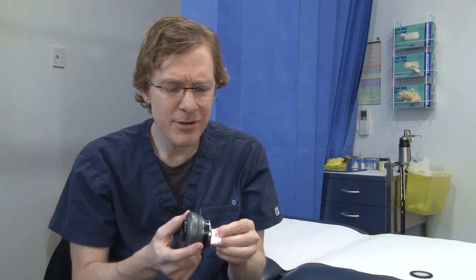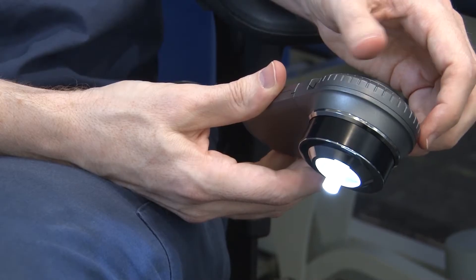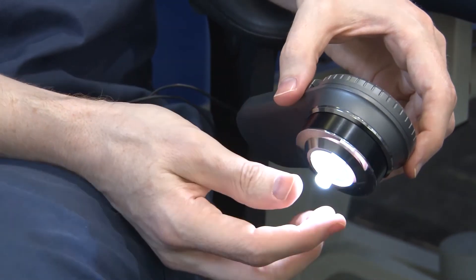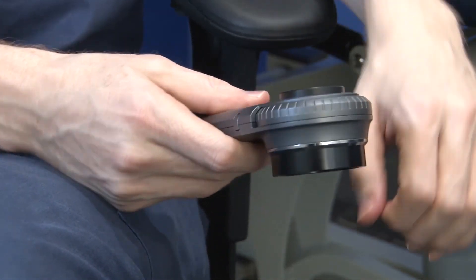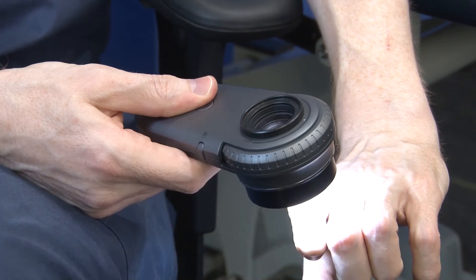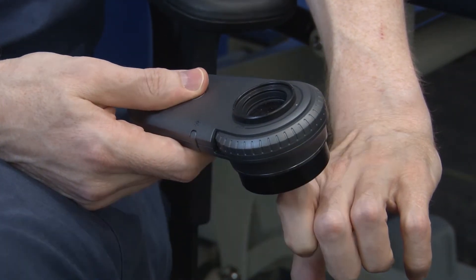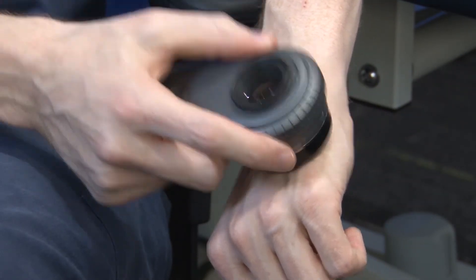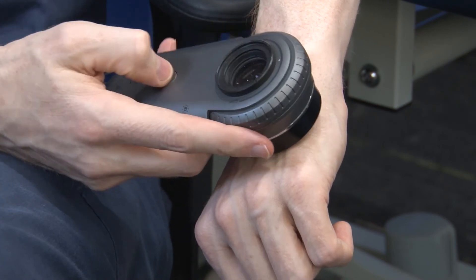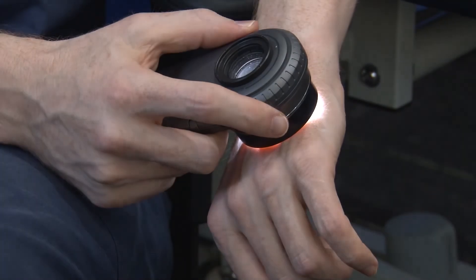That's a very strong magnet, really easy to pull on and off. You don't have to have any attachment on, in fact. You can have that completely removed and just look at a raised lesion and manually focus it that way. Or perhaps if you've got a pink vessel that you want to have a look at without compressing the vessels, make sure you've got the plate off so that you get the best possible picture.